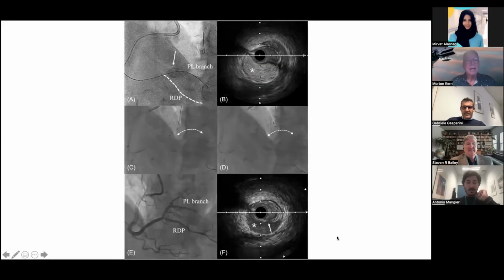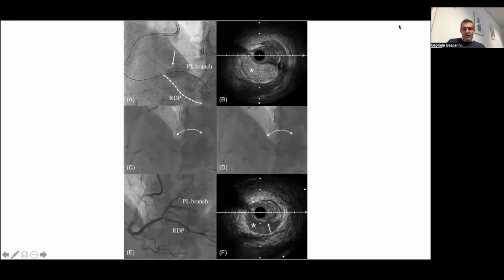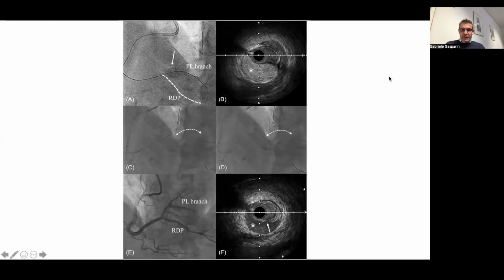Yeah, so we're going to discuss this technique that we recently published, called the cuttering technique. Cuttering is a combination between cutting and dottering technique. So it means that we have to adopt two different techniques, because usually when you have to deal with coronary artery dissection, the main problem is represented by the intramural hematoma, because it often creates an impairment of the distal flow. So when you have to deal with a flow-limiting hematoma, the only chance that you have is to create some fenestration using the traditional inflation of a cutting balloon. This has already been described in the literature.